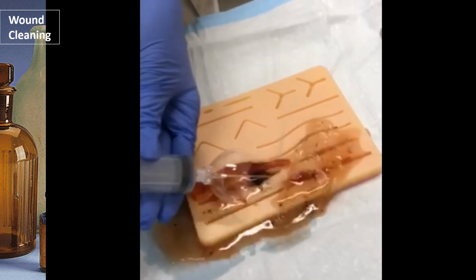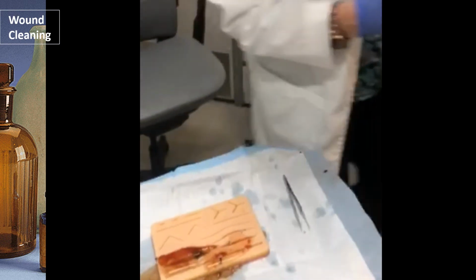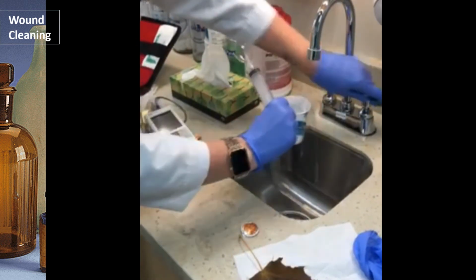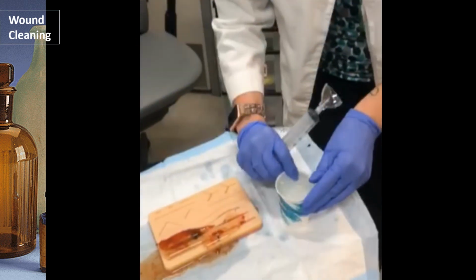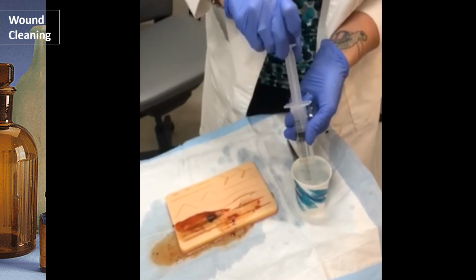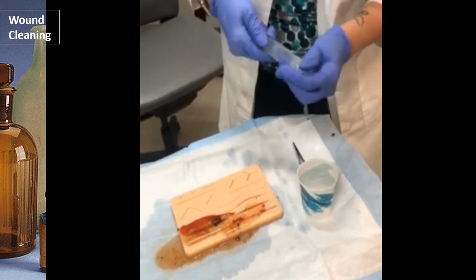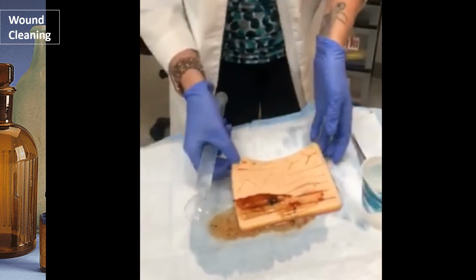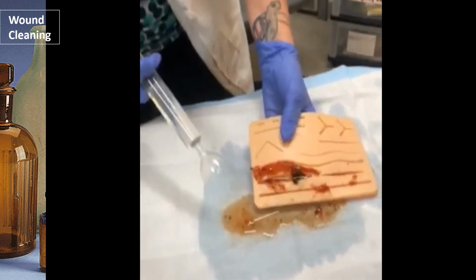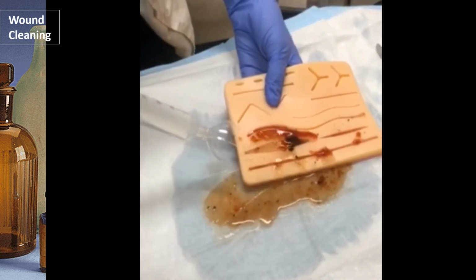All right, we have a lot of debris in here. Yep, see, splashback. All right, so I'm gonna grab some more water. And again, you'll see I'm just using normal tap water. Now on a human body, this would be on an arm or a leg. So I'm just going to use my fingers to pretend like that is. So I'm just cleaning this out.